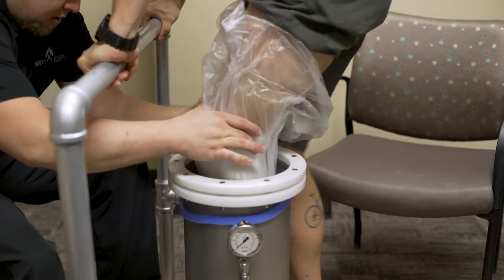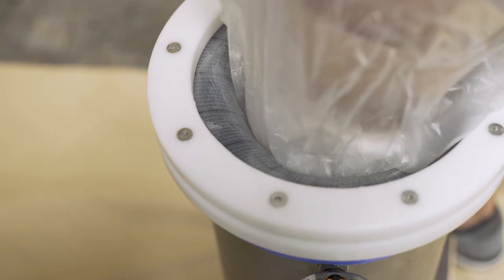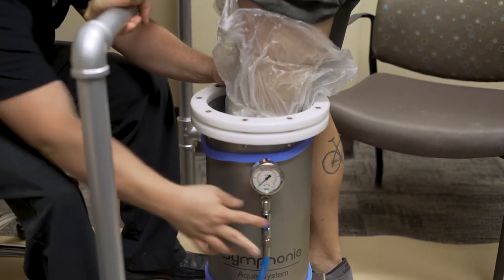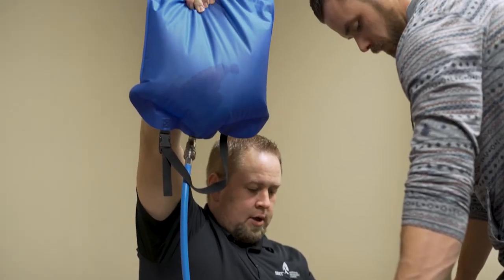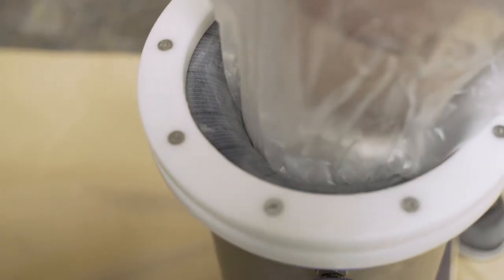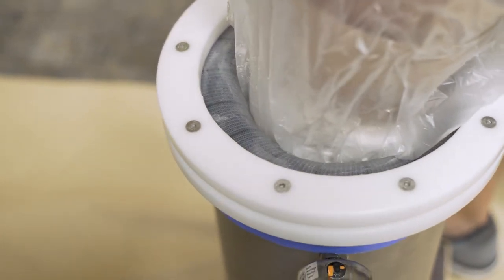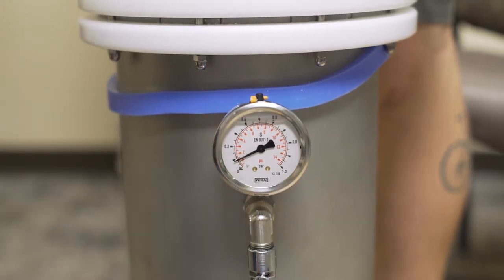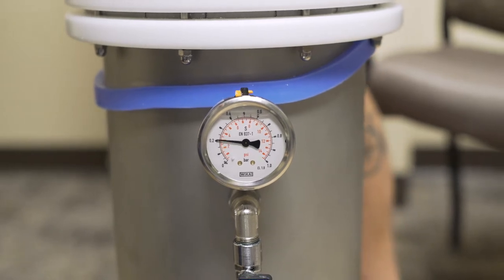Have the patient stand with support while dangling their leg into the Symphony Aqua system cylinder. It is important that they will not be weight-bearing during this phase. Once the patient's limb is placed inside the cylinder, open the valve and lift up the bag to allow water to flow into the cylinder. Water will begin to flow in and the membrane will begin to add pressure to the limb. Close the valve — the needle will begin to move as pressure is applied.